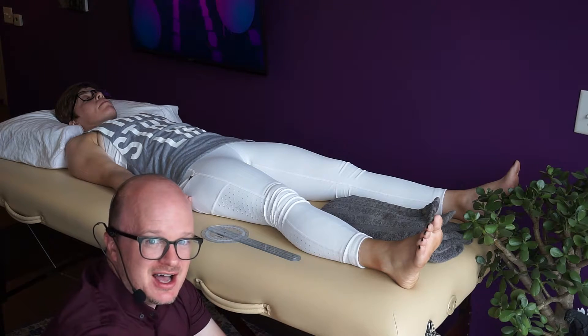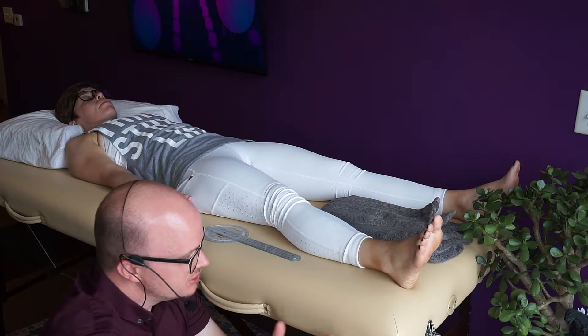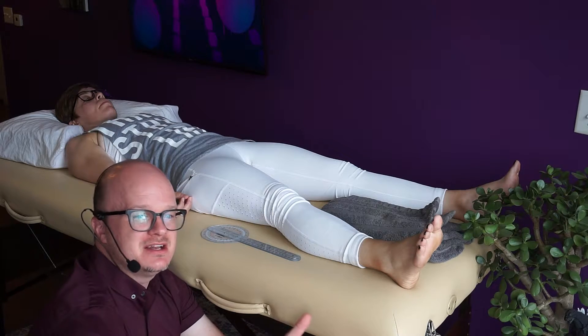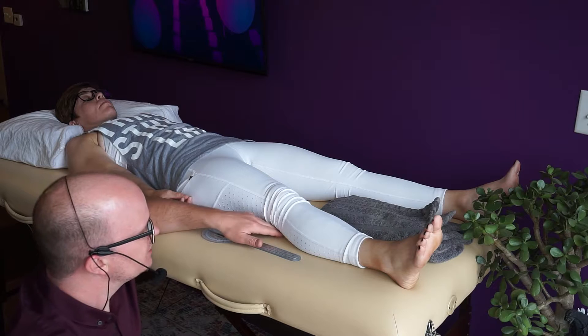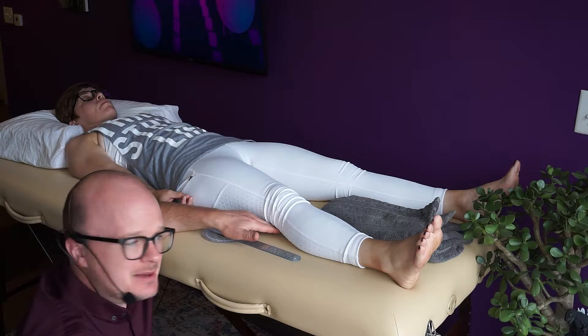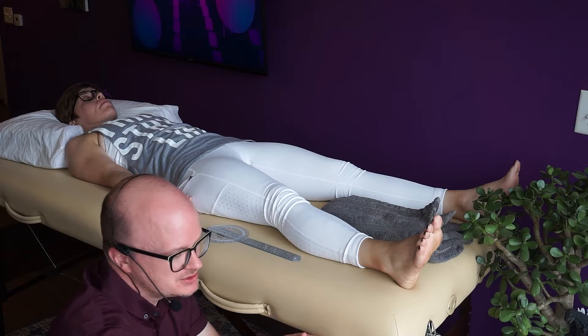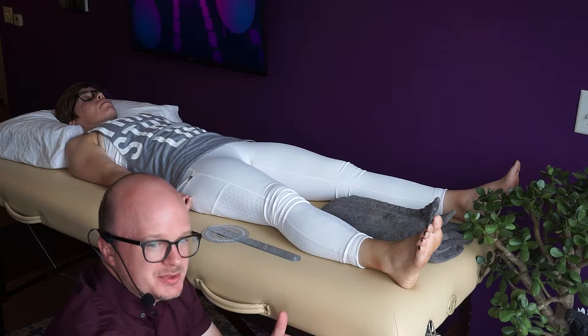The most common end feel is a firm end feel. If you take stretching your hamstrings, for example, that's a firm end feel. Knee extension will also be a firm end feel because you're stretching the posterior capsule. We want to find those end feels for all measurements — whatever the normal end feel is, we want to find it.